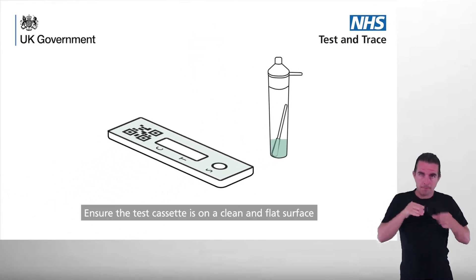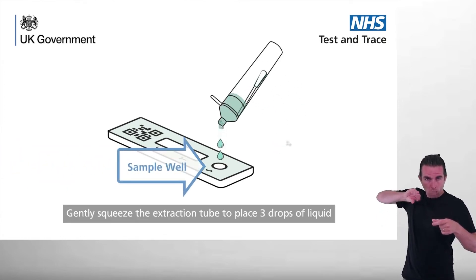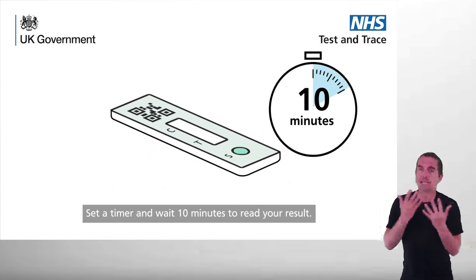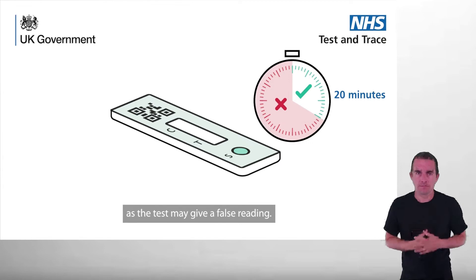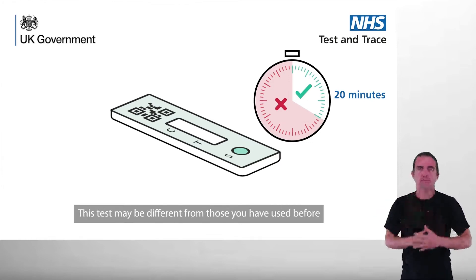Ensure the test cassette is on a clean and flat surface. Gently squeeze the extraction tube to place three drops of fluid onto the sample well on the test cassette. Set a timer and wait 10 minutes to read your result. Do not leave the test to develop for longer than 20 minutes as the test may give a false reading. This test may be different from those you have used before.